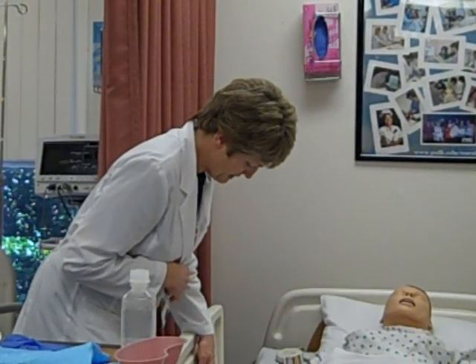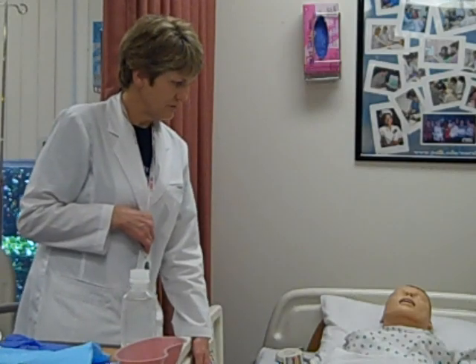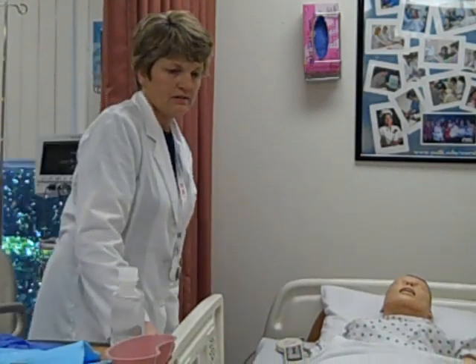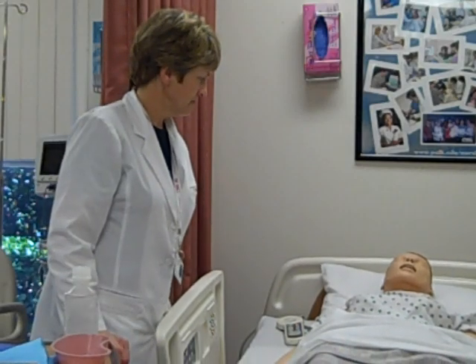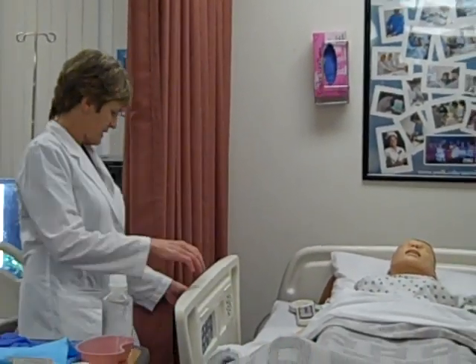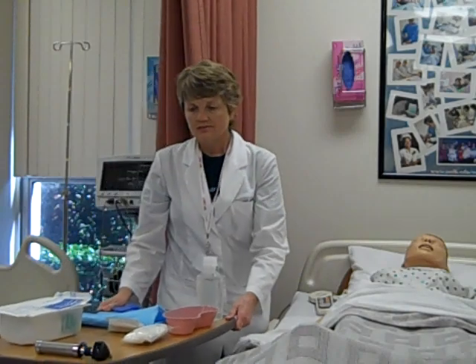I've explained the procedure. I'm going to provide safety and make sure that I provide privacy. I am going to raise the bed so I don't hurt my back. I am going to put the side rail down and bring my supplies over.